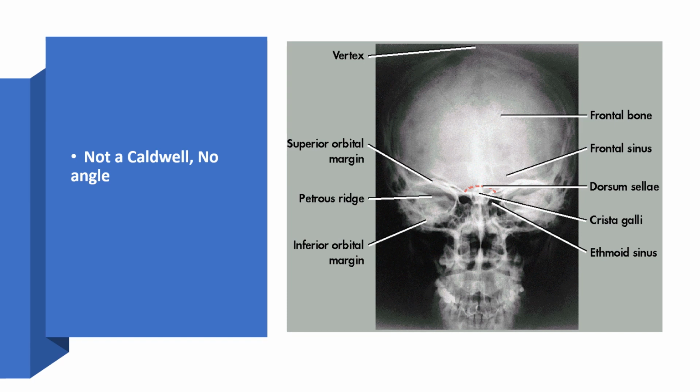PA projection is more looking at the frontal bone and its junction to the parietal bone and the more superior portion of the frontal bone, because we've actually increased the superimposition of structures in and around the orbits for this projection. So the whole point of the 15-degree down angle is the structures around the orbits spread out a little bit, and the petrous pyramids descend a little bit on the Caldwell projection, so you can see more of the orbits on a Caldwell than you can on a straight PA.